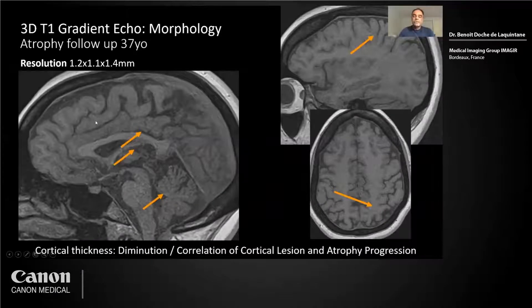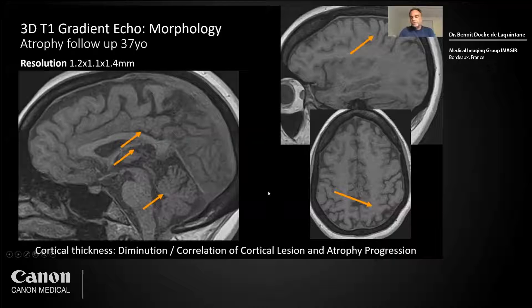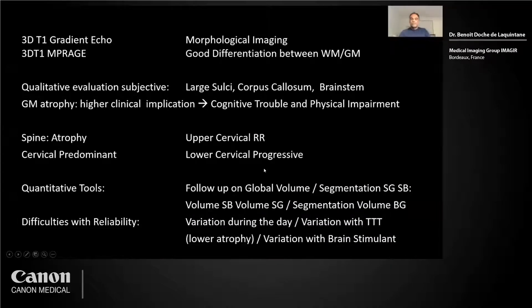For other morphological sequences, I use the 3D T1 gradient echo. Here is a 37-year-old man — resolution is nearly isotropic — you see a smaller corpus callosum, a smaller cerebellum, and large sulci. Cortical thickness can also be studied with atrophy progression. The cortical lesion correlates with atrophy progression. The problem with follow-up of atrophy is that it's first a qualitative, subjective evaluation looking at sulci, corpus callosum, brainstem volume, and gray matter atrophy has a higher clinical implication for cognitive trouble and physical impairment.